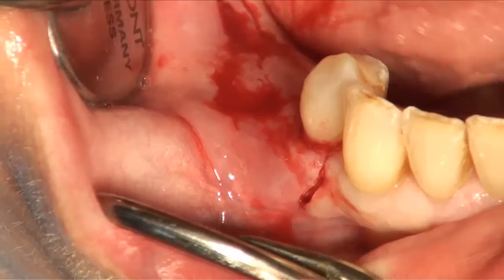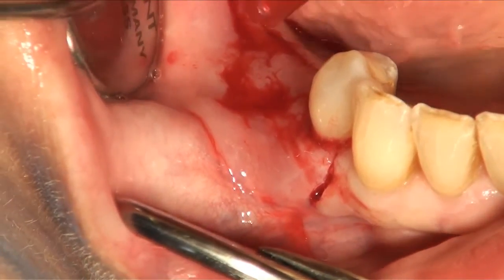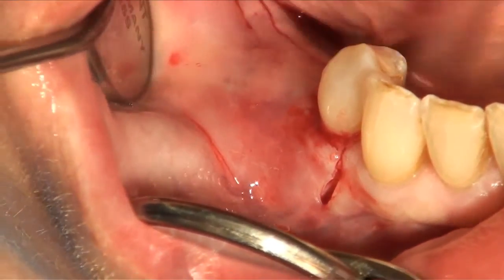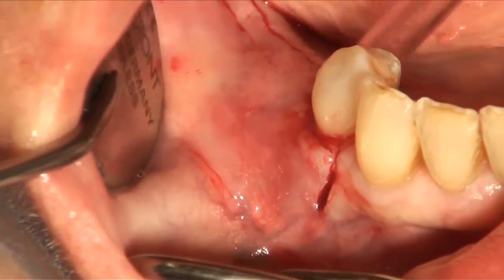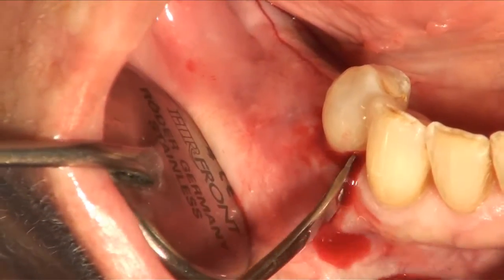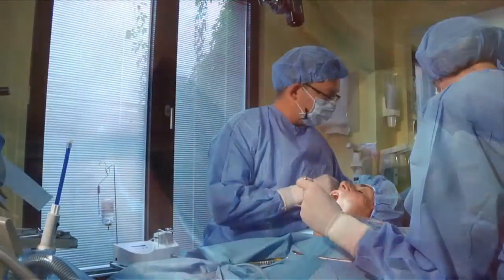So the incision is performed, and now we will reflect the flap, opening up the site, and also we will find our expander in place.